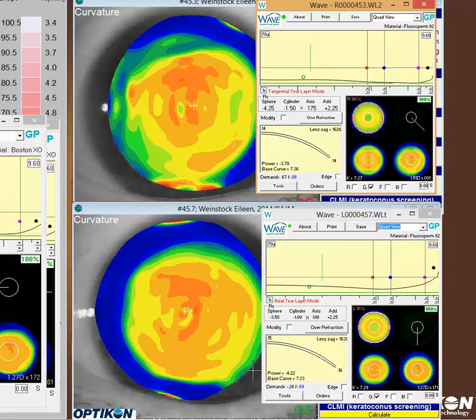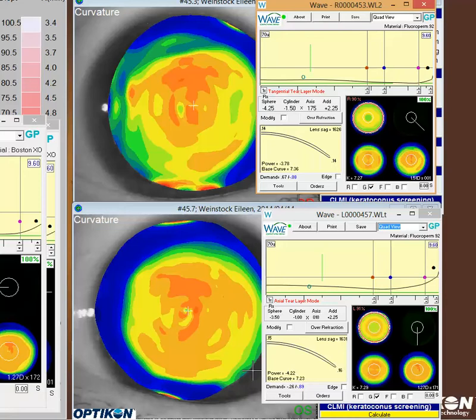There are two ways to maximize that zone. One is to decrease the back optical zone by moving the pink dot and the blue dot to smaller. The other option is just to go larger on the lens — either of those will give you a larger landing zone. Usually it's safe to go a half millimeter or a millimeter larger to start than their habitual lenses. If you're already in that larger zone from the habitual, then your best choice would be to reduce this optical zone.